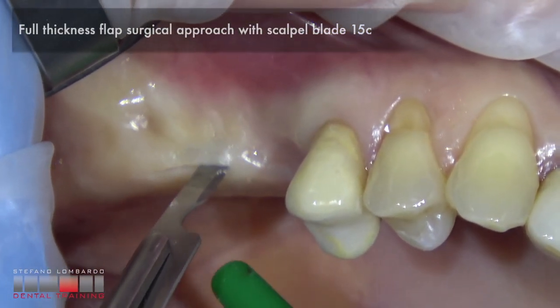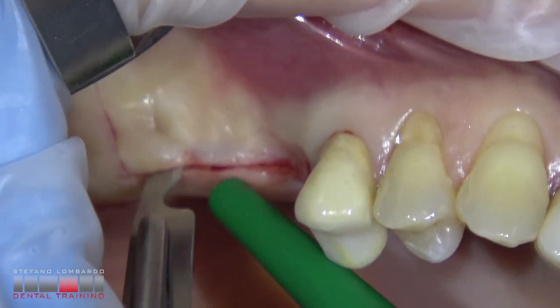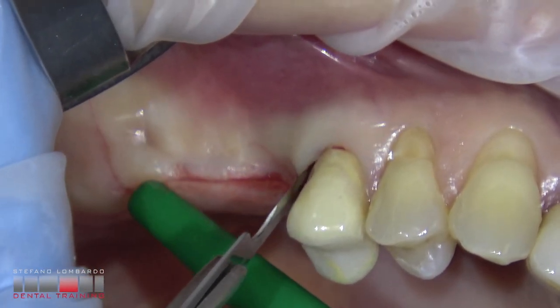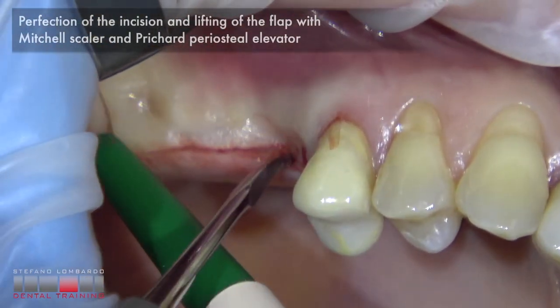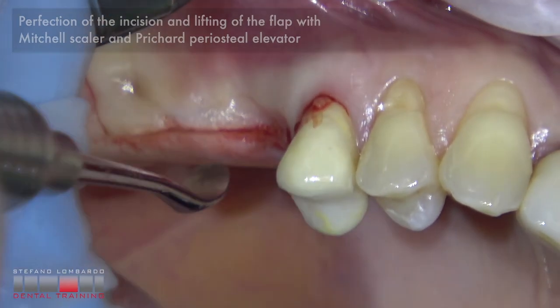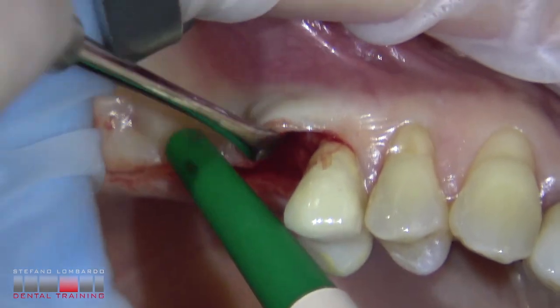The full thickness flap surgical approach is performed with scalpel blade 15C. Perfection of the incision and lifting of the flap with Mitchell scaler, followed by periosteal elevator.